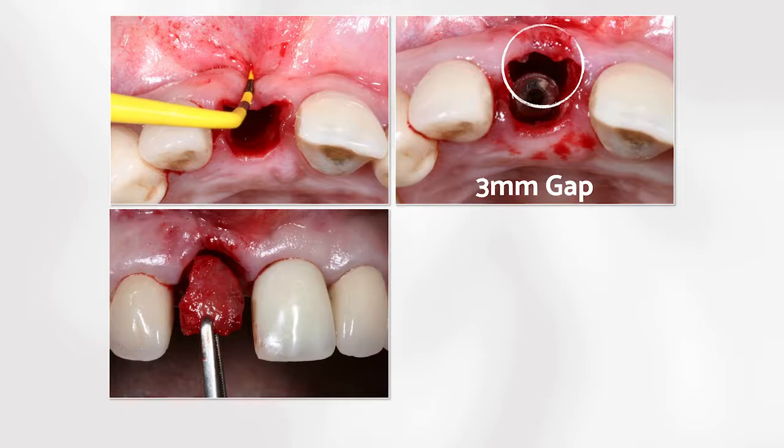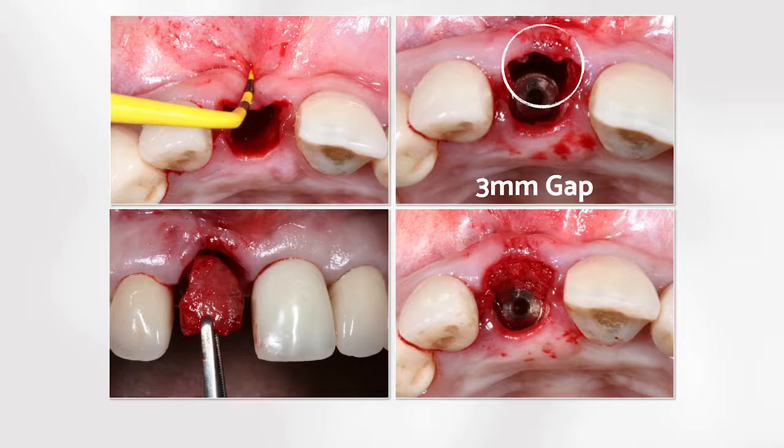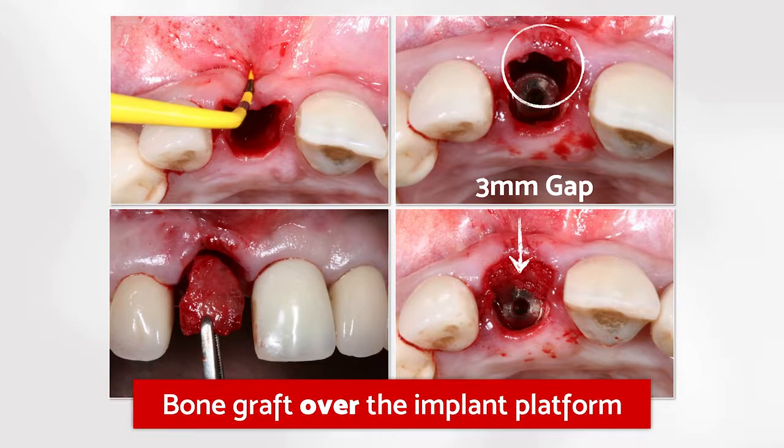The bone graft was taken from the right side, and here you can see it after bone graft manipulation. And pay attention that at the buccal aspect of this graft, at the cortical layer, we have a high vascularization. After bone graft insertion, the particulate bone was condensed, and we filled this area all around the head of the implant, and we left bone graft over the implant platform.